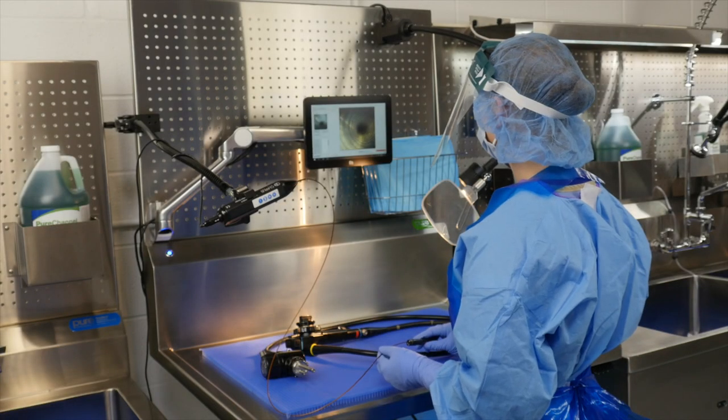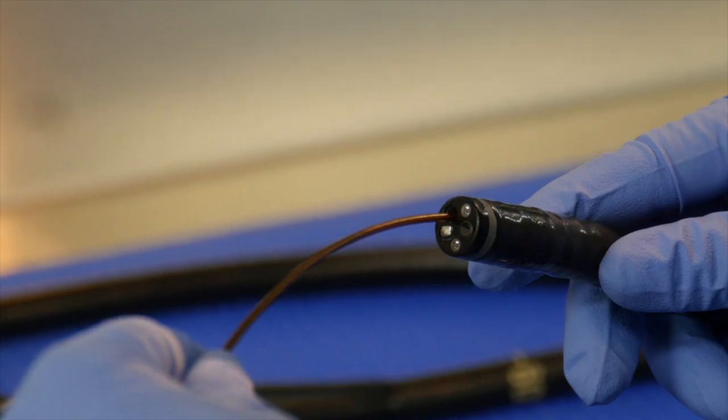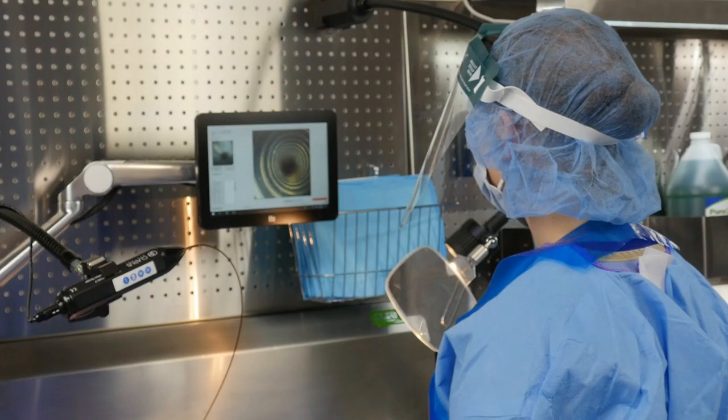Rigid and flexible scopes require rigorous quality measures. ST79 states that technicians are to verify the cleaning process by inspecting the scope with enhanced visualization tools to reveal any residual soil, fibers, and interior scope damage.